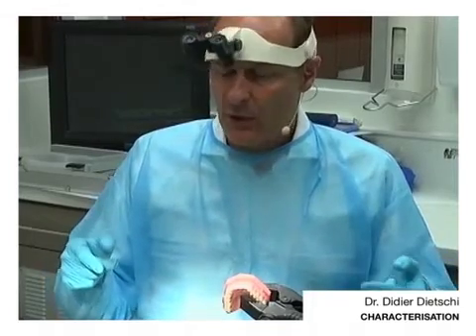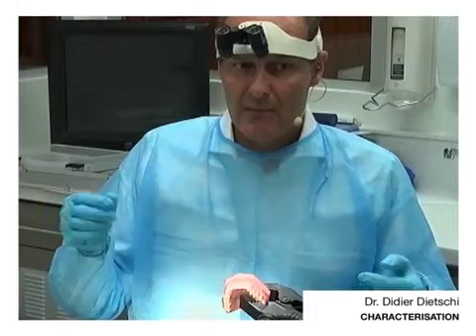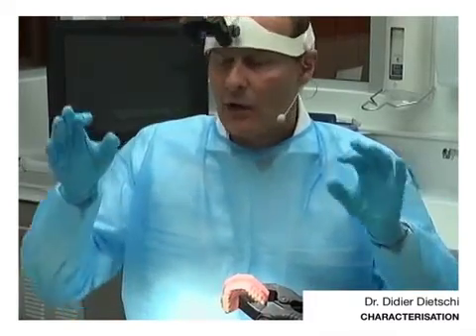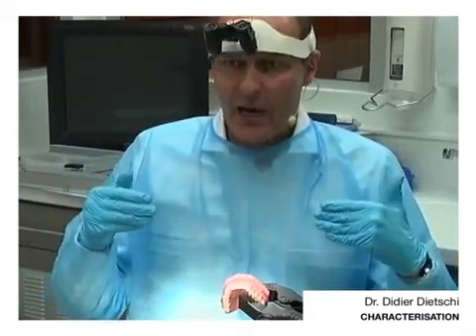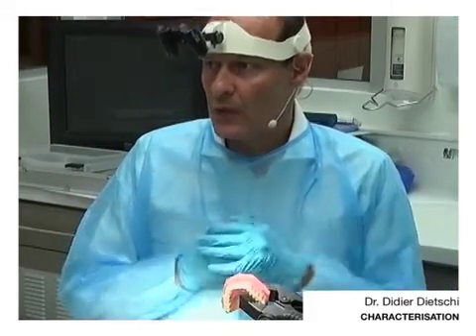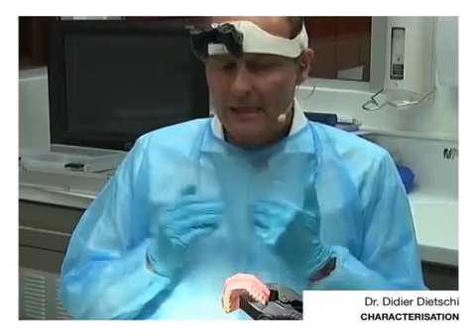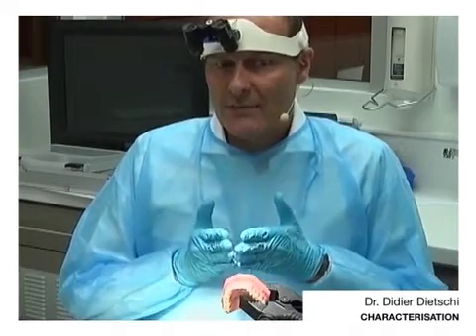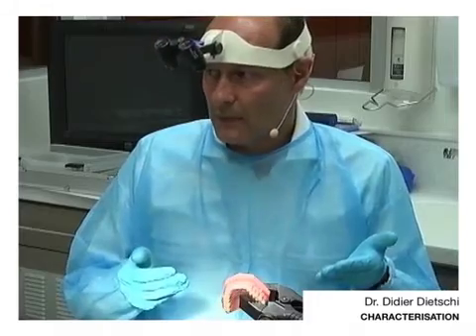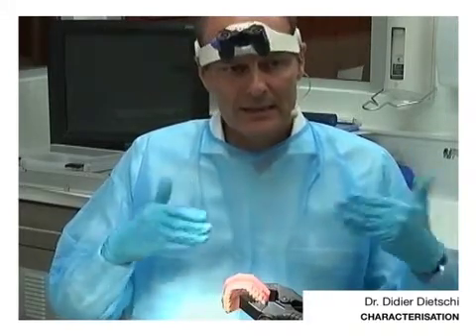But neighboring teeth, which are pretty much intact, have a lot more translucencies. Maybe they have a little bit more chroma in the cervical. Maybe they have a couple of white spots. They are not looking, so to speak, as perfect as the veneer which I have now placed. So if I use the same technique, I will end up with something which is probably more perfect, much more uniform and perfect than the existing teeth.